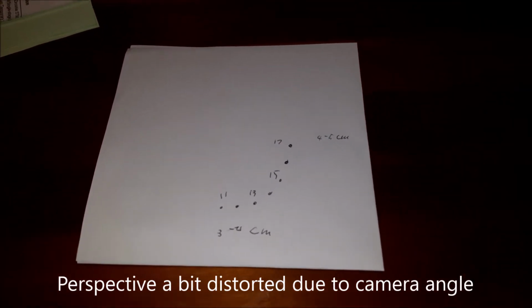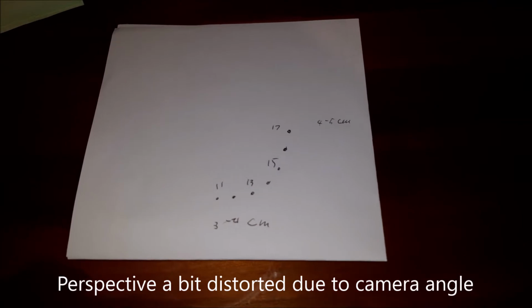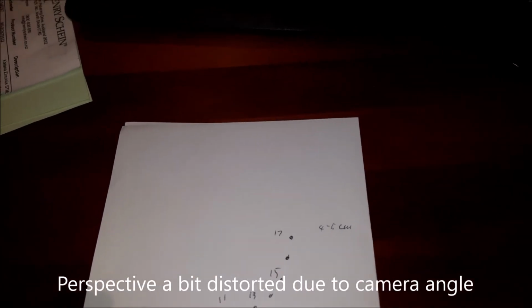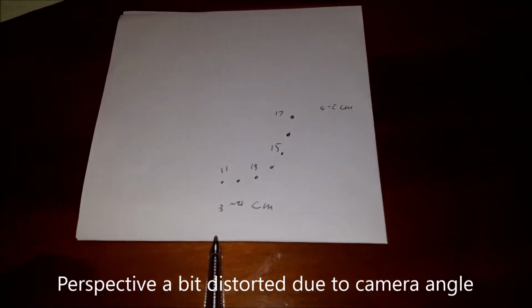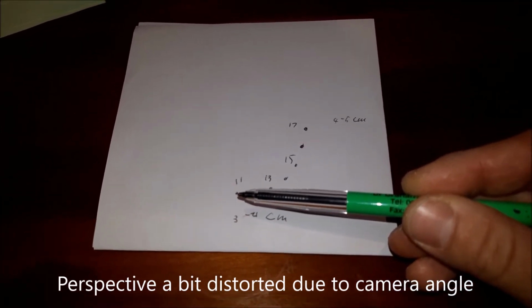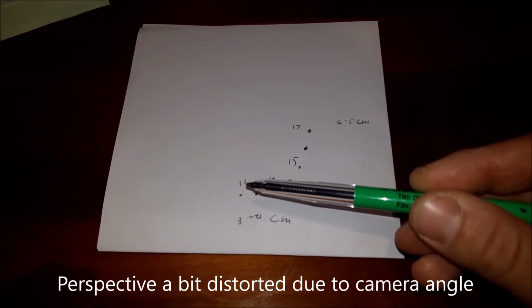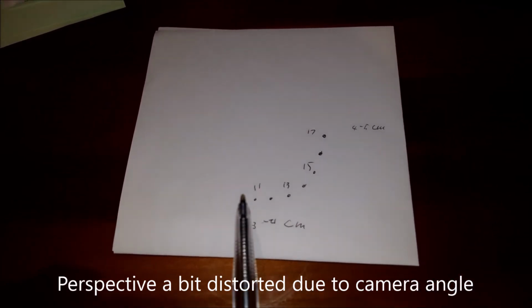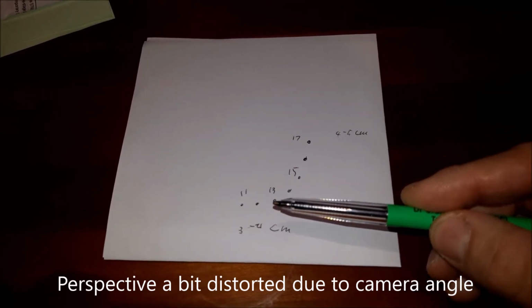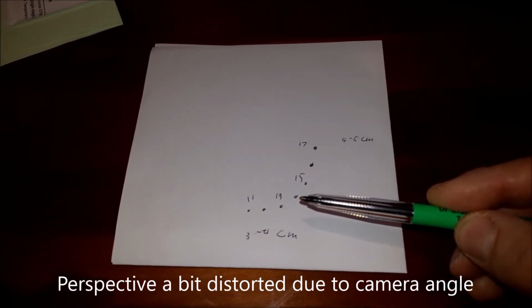Forgive the use of the paper. We are currently limited in the amount of rubber dam we are allowed to order. So the first point of reference would be in the middle at the top, about 3 to 4 centimeters down. That would give you the position of the central. Now we're doing the first quadrant, so that'd be 1-1, canine, and then we follow the arch.